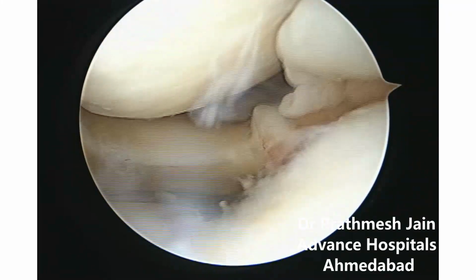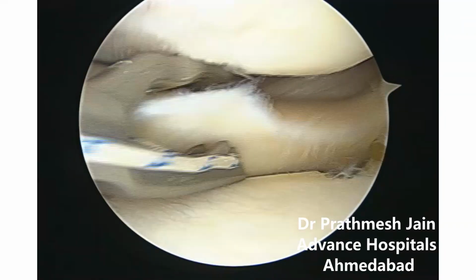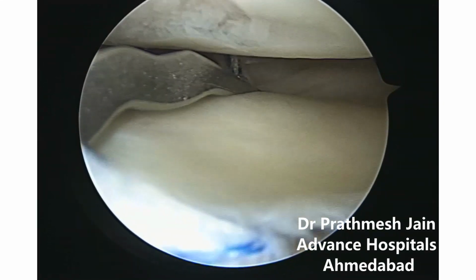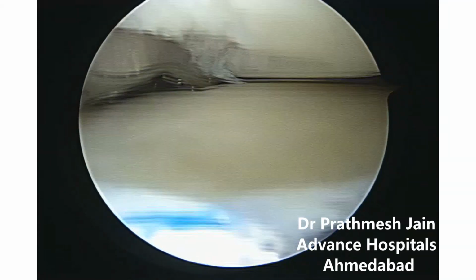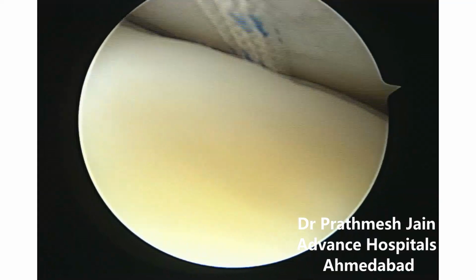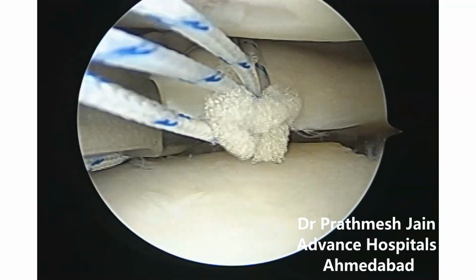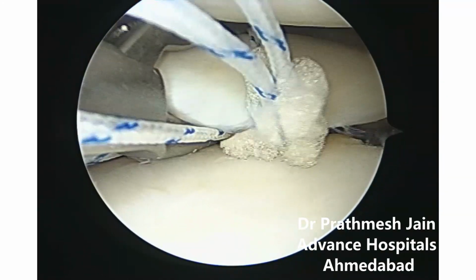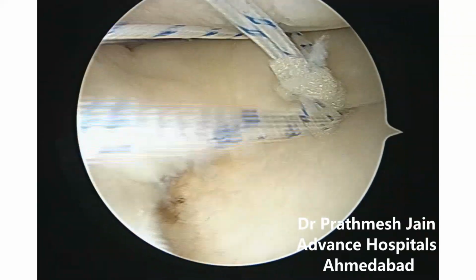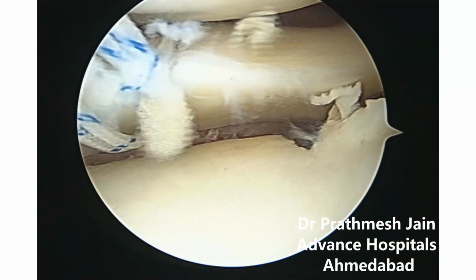At this point, we will be passing the sutures through the meniscocapsular junction. That is the repair pass. We are using a FirstPass Mini suture system here to repair the meniscus nicely in this particular case. We usually use two, and we try to pass these sutures more on the medial aspect so that we can have a very effective reduction of the meniscus extrusion. So we pass it on the medial aspect, a minimum of two sutures are passed, and we cinch these sutures. So eventually we have four suture limbs which we need to tie back.